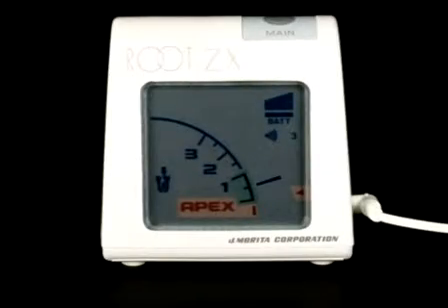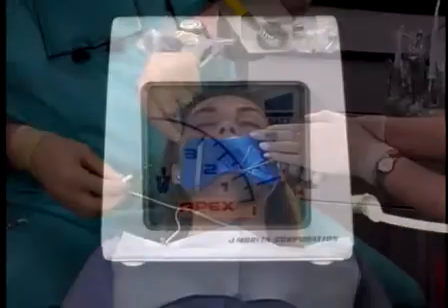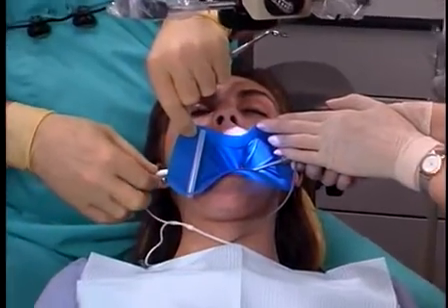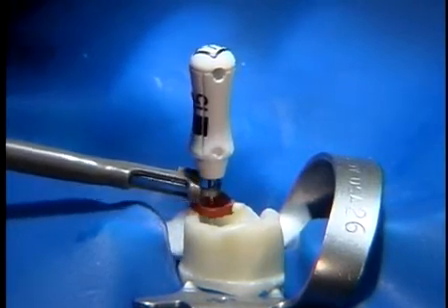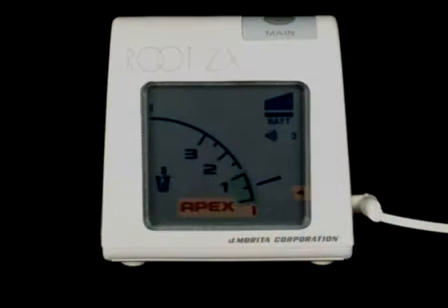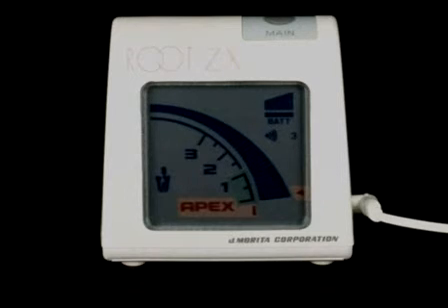With experience, certain electronic apex locators can provide valuable, accurate, and reliable information as to working length. In use, the clip is attached to the patient's cheek, while the lead is attached to the shaft of the file. As the file moves progressively deeper into the canal, we're at length when the display panel reads apex.